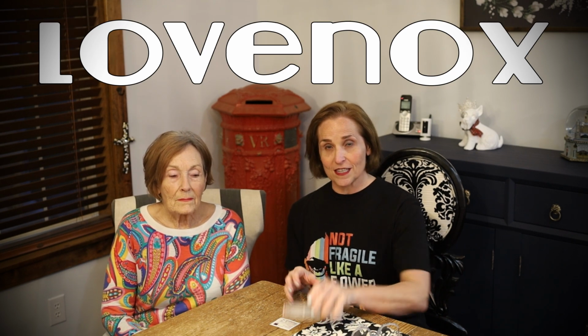Now she's getting ready to have her rescheduled procedure, but her cardiologist and I decided that she probably needed to be bridged with Lovenox, as discussed in one of my previous videos, because she needs to be on some sort of blood thinner that doesn't have a super long half-life. So we are going to show you how to dose Lovenox. Ow.